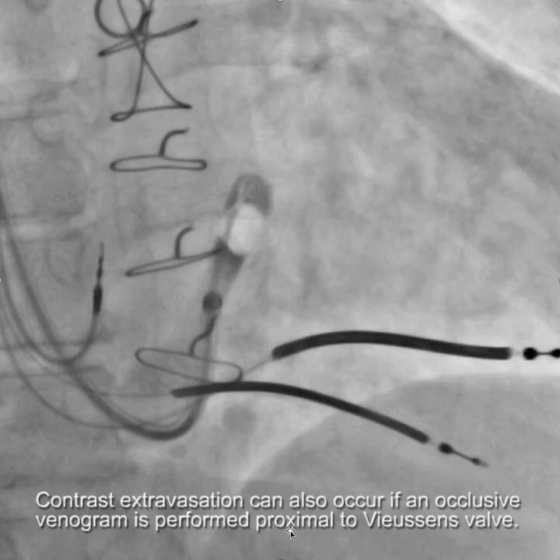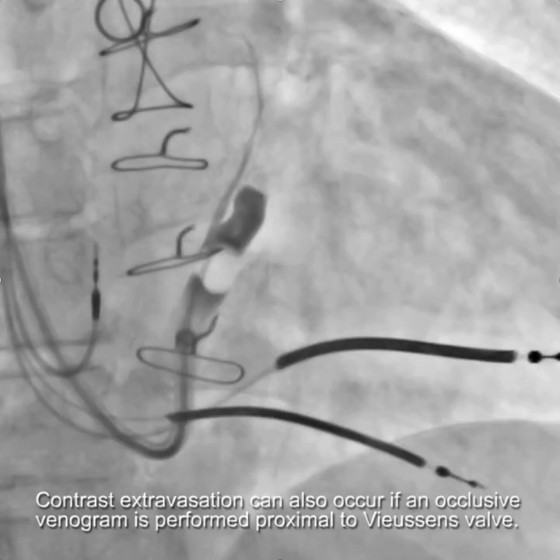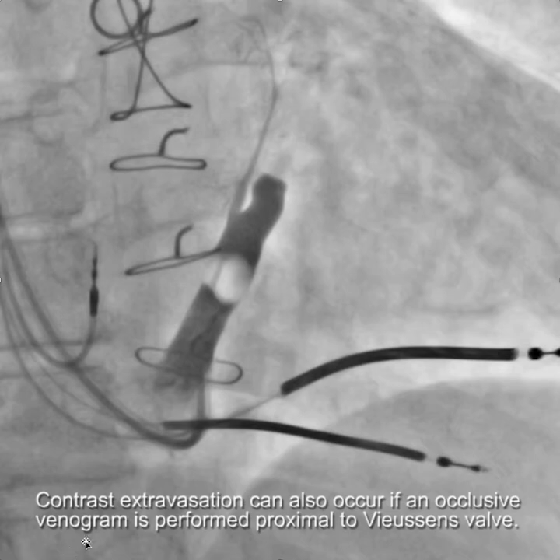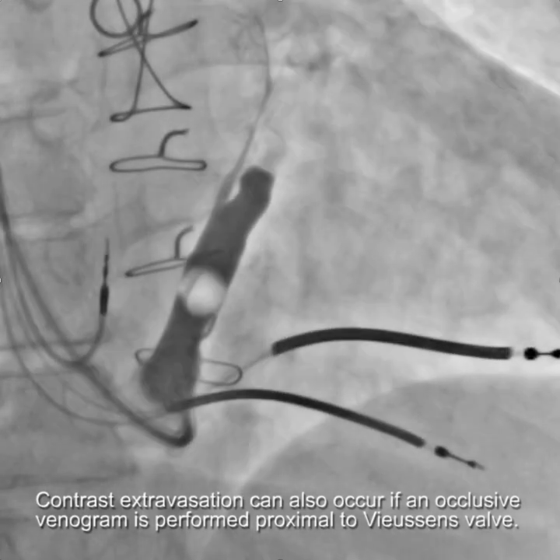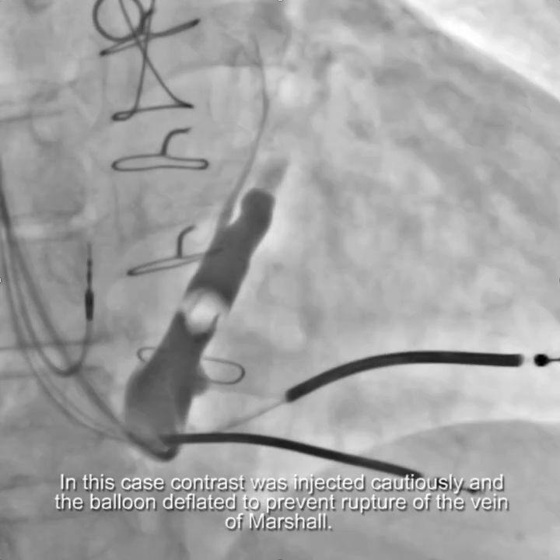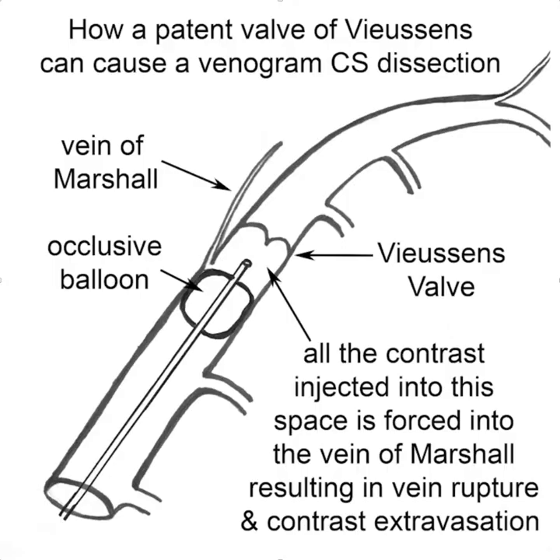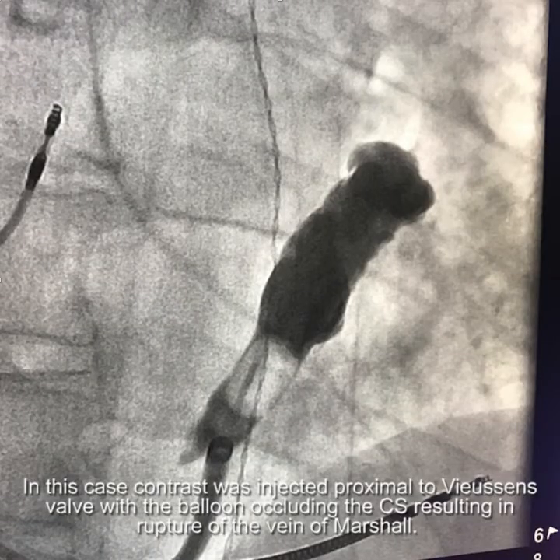Contrast extravasation can also occur if an occlusive venogram is performed proximal to Vusensian's valve. In this case, it was recognized that we were below Vusensian's valve, so the balloon wasn't fully inflated, and contrast injection was done very carefully. If you inflate the balloon below Vusensian's valve and Vusensian's valve is patent, all the contrast that is injected has really only one place to go — into the vein of Marshall — which can result in rupture and contrast extravasation. It turns out to not be too dangerous, though not as bad as if you put the balloon into the vein of Marshall itself.